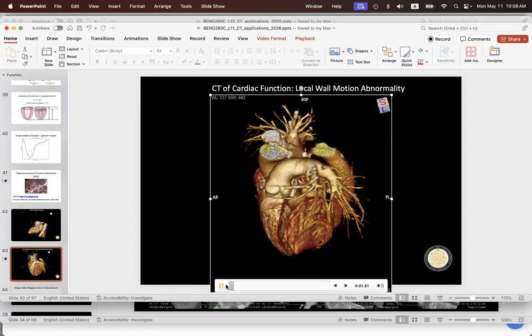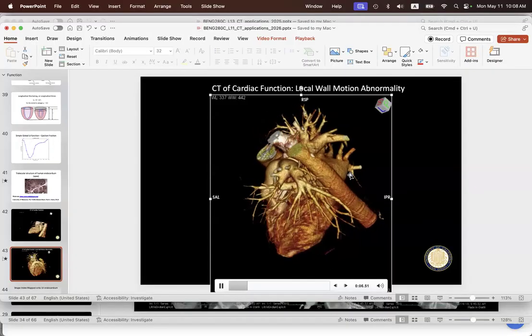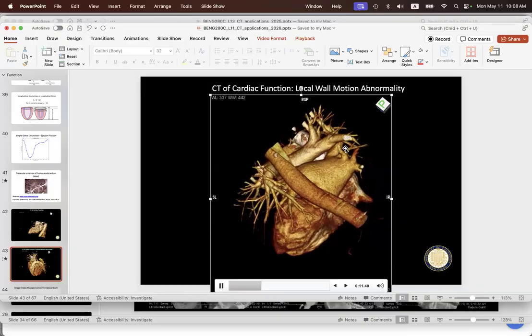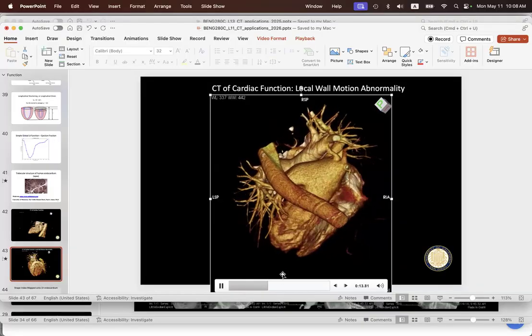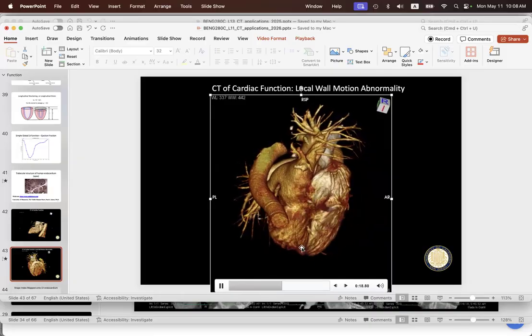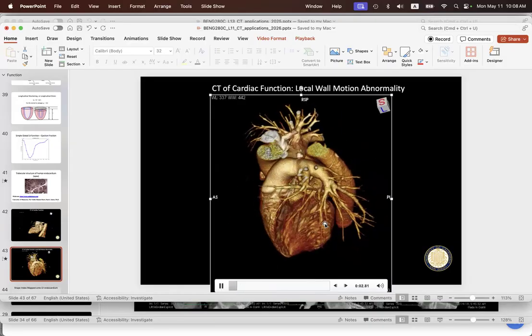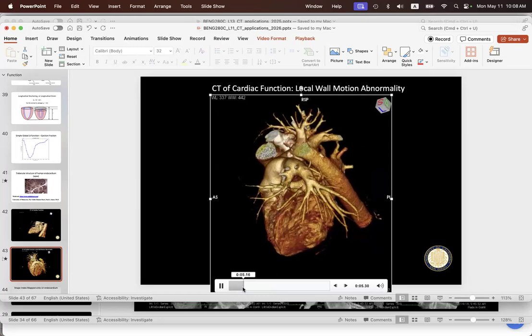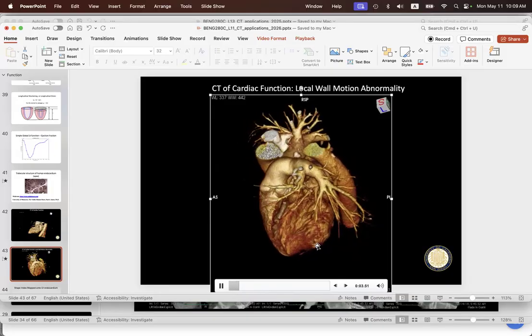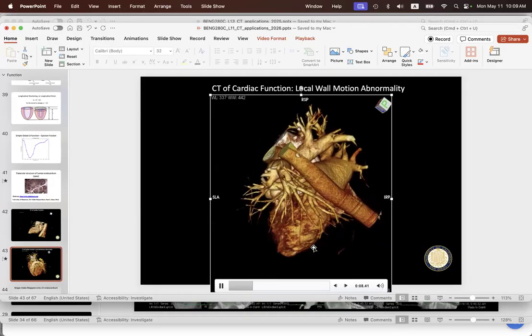And here you can see in a heart, a lot of the additional tissues are in there. The right ventricle is in there. Essentially the pulmonary vein is still being lit up. But what I want to demonstrate with this, even though we're seeing all the right side of the heart here, is the left side of the heart, which is kind of tucked away back there. So this is the left ventricle. Look at this golf ball that's on the side of the surface of the left ventricle. That's the apex. There's this thing right here. It is not deforming at all, right? It is just being taken along for a ride.